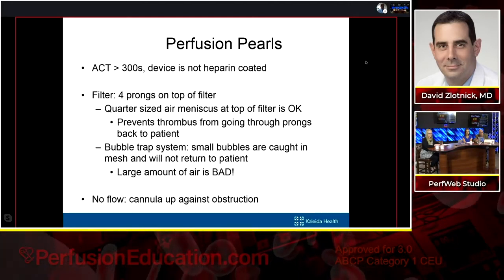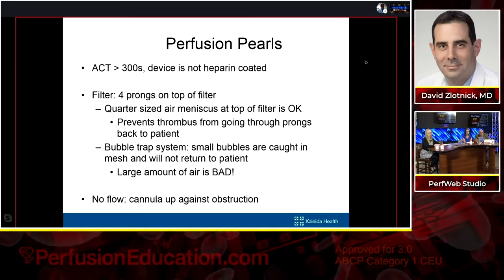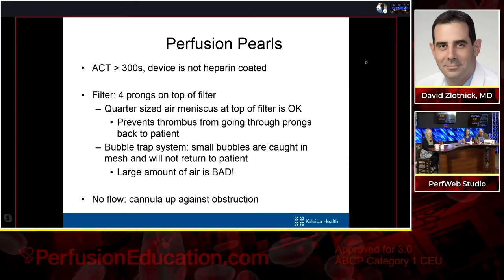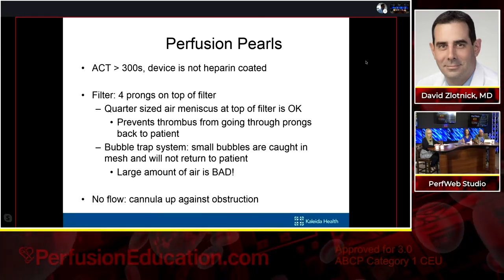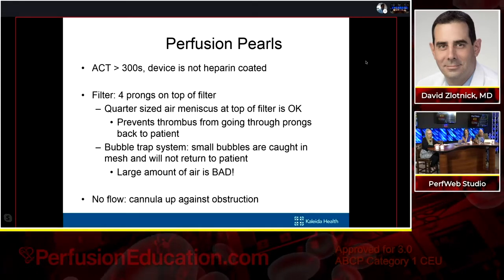Hey, where are you? Are you up against the wall? Are you up against an obstruction? Because if we are up against the obstruction, we obviously want to stay on flows because we've captured it. We want it to work its way into the cannula so it doesn't flick off and embolize. So really, having an ongoing conversation will be an overall theme on this: to always have a conversation with everybody in the room that's participating in these procedures.